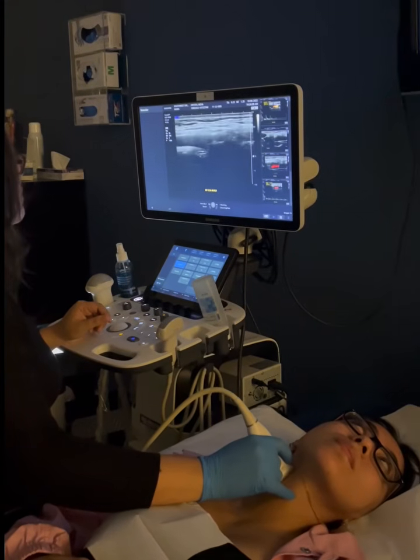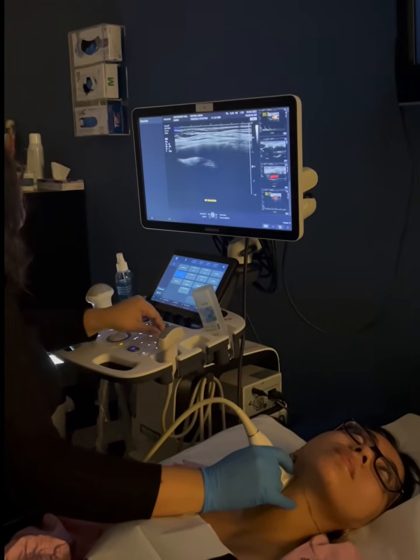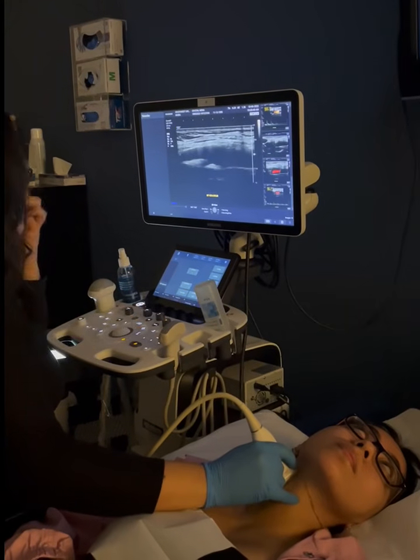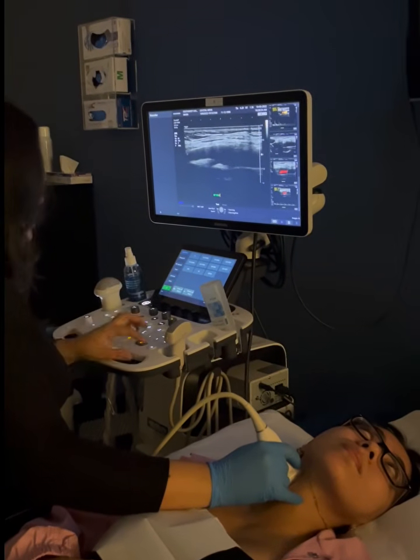The only way to know for sure if you're evaluating the ECA or the ICA is to pulse wave both. They're both going to give you two very different waveforms. But here Myra followed the smaller vessel to the ECA and angled towards the face.